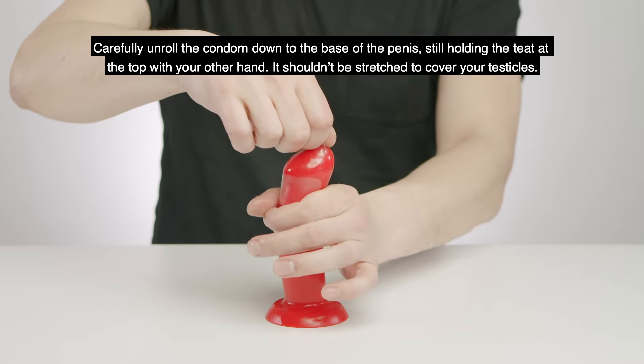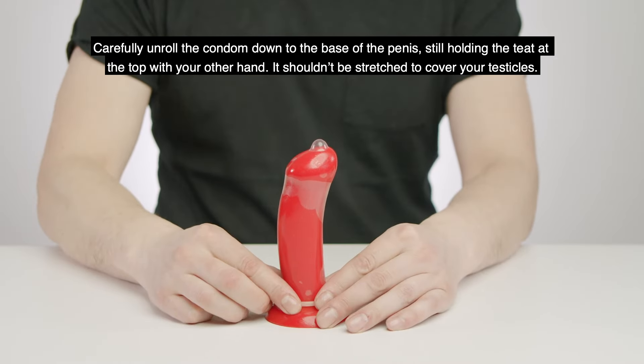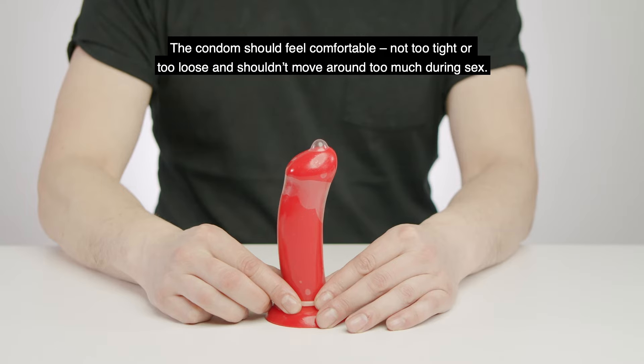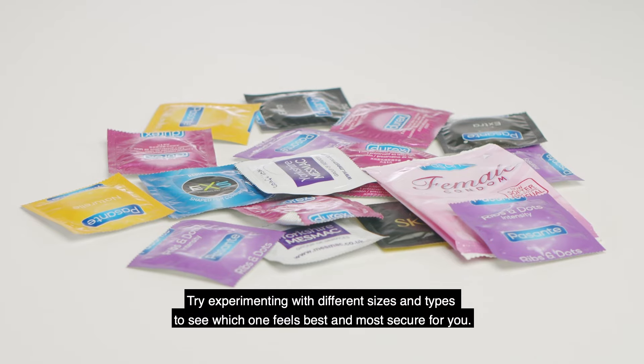Carefully unroll the condom down to the base of the penis, still holding the teat at the top with the other hand. It shouldn't be stretched to cover your testicles. The condom should feel comfortable — not too tight or too loose — and shouldn't move around too much during sex. Try experimenting with different sizes and types to see which one feels best and most secure for you.